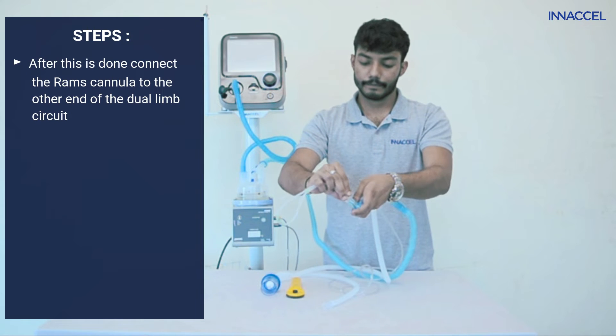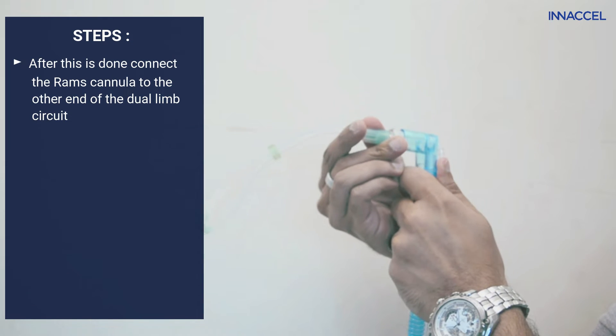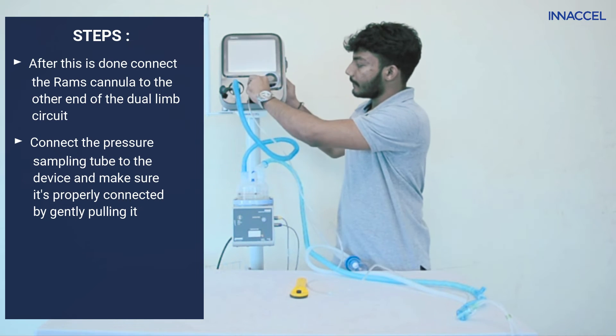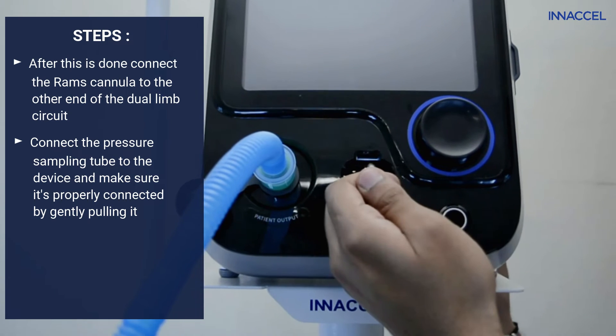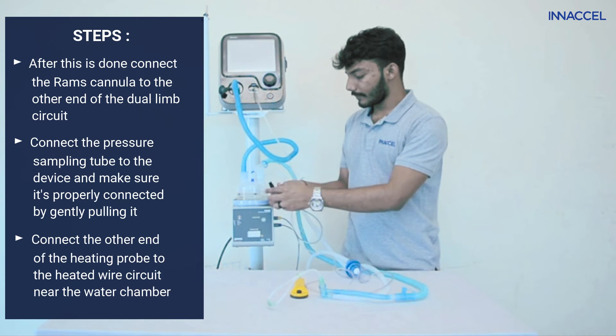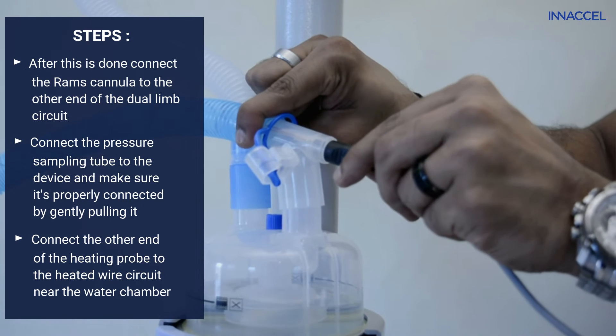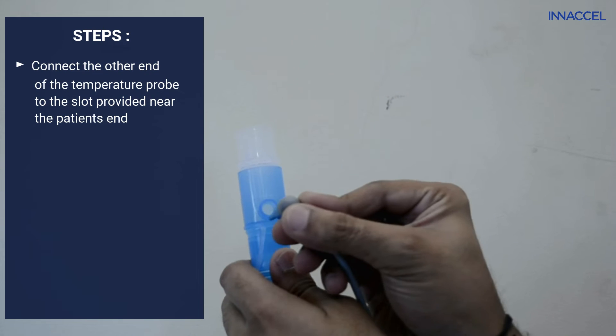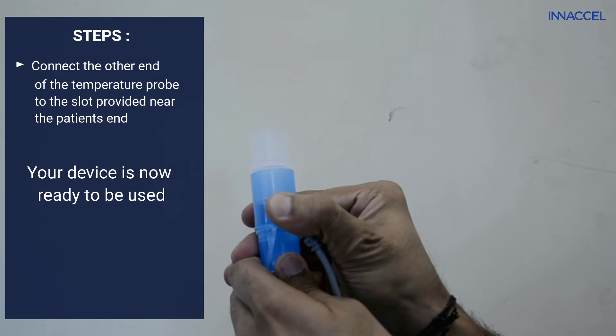After this is done, connect the RAMS cannula to the other end of the dual limb circuit. Connect the pressure sampling tube to the device and make sure it is properly connected by gently pulling it. Connect the heated probe to the heated wire circuit near the water chamber, and connect the temperature probe to the heated wire limb near the patient's end.